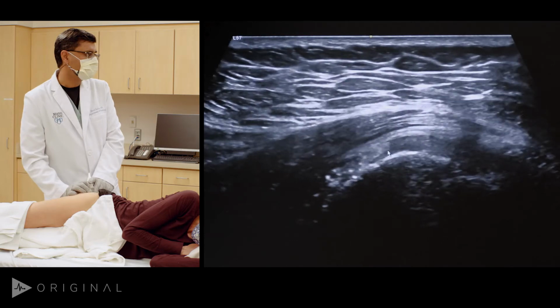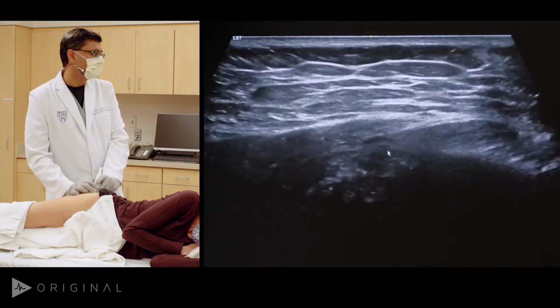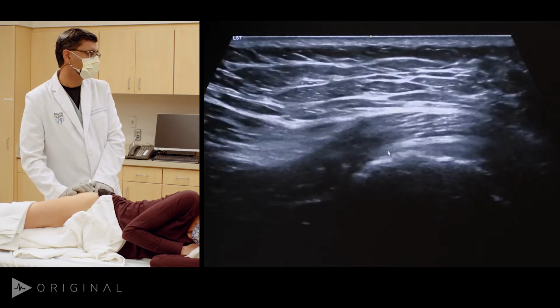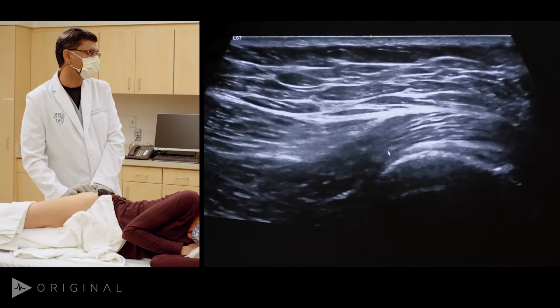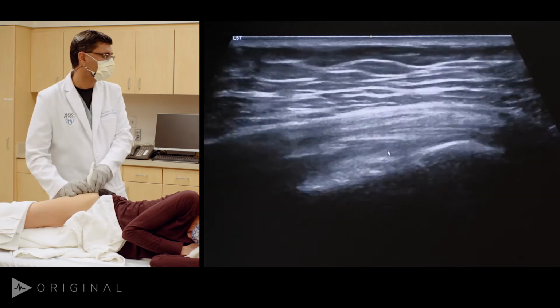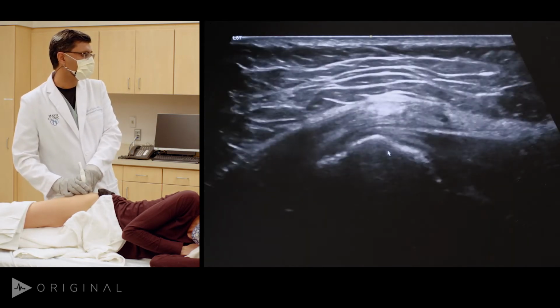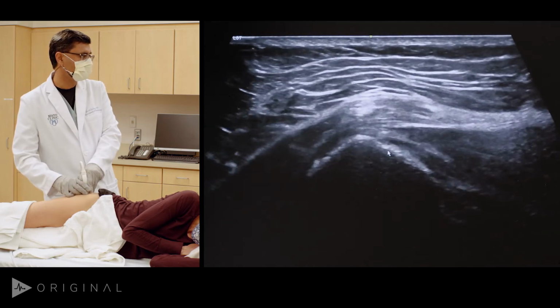And this tendon has two components. One component is going anteriorly, and the second component, far posterior, is much bigger, and that is going to go posteriorly. So when I make a long view at the lateral trochanter, it's very important to go back to your transverse views, to make sure you don't get confused and start imaging the gluteus minimus again.